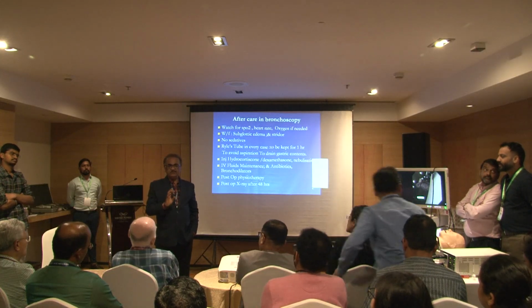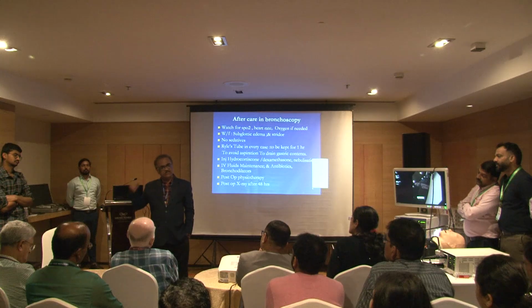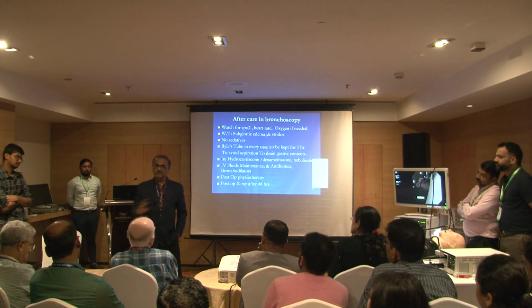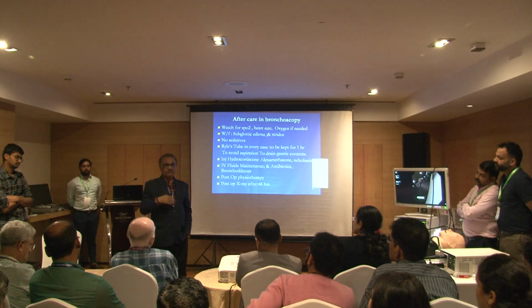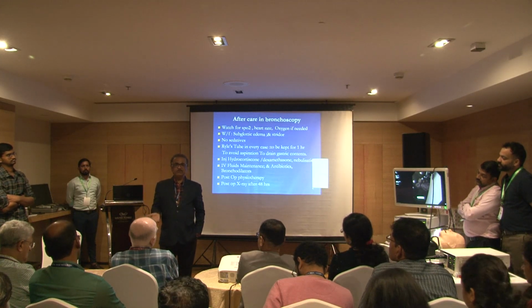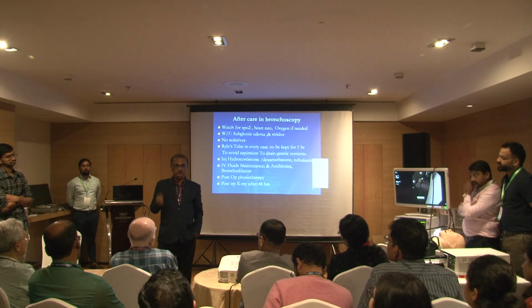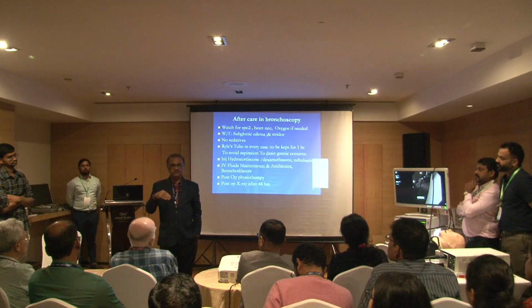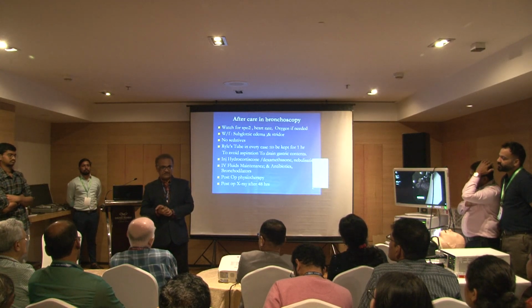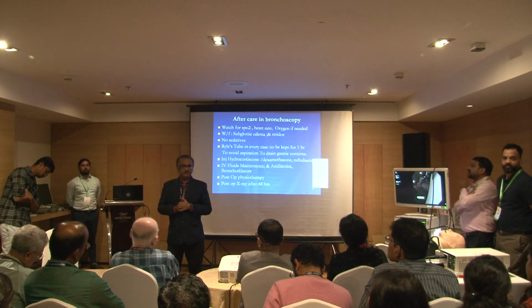Stopping or abandoning the procedure is done if the anesthetist says so, if the patient's condition says so, and if the foreign body and surrounding situation is not very good. So you can try and attempt, there is no issue. Second scopy is done preferably with one more ENT surgeon or one more scopist involved rather than you going in alone, because the patient also is more convinced that my doctor is taking one or two more doctors to help my child. Okay. So I'm not saying that you should not do it, but it is always better that you have one more guide.